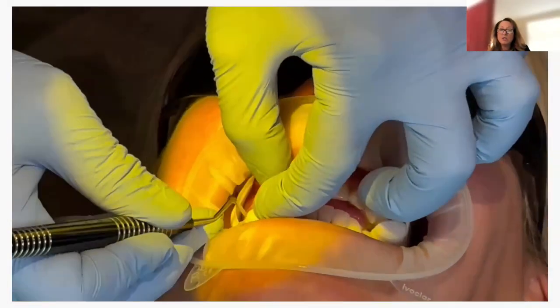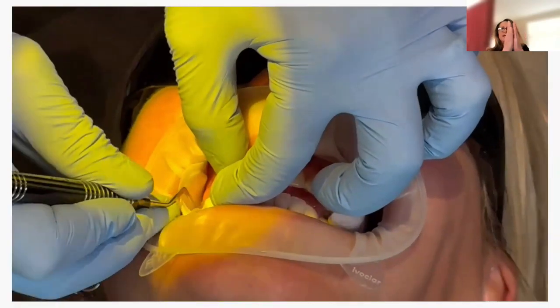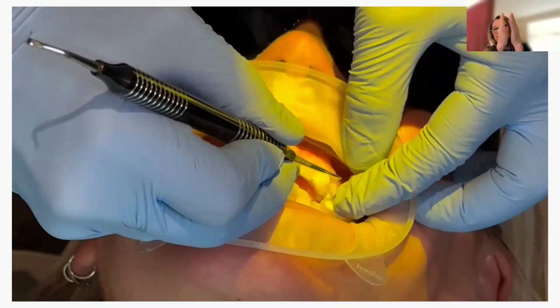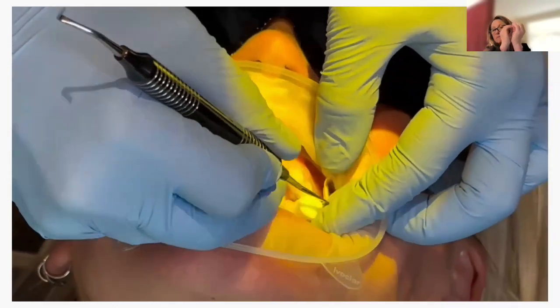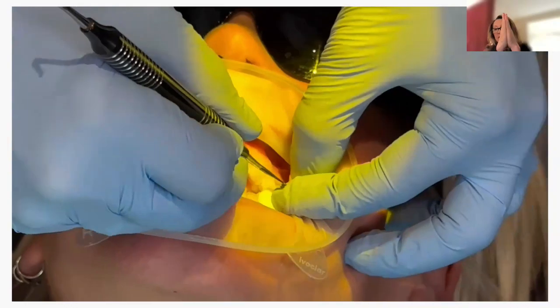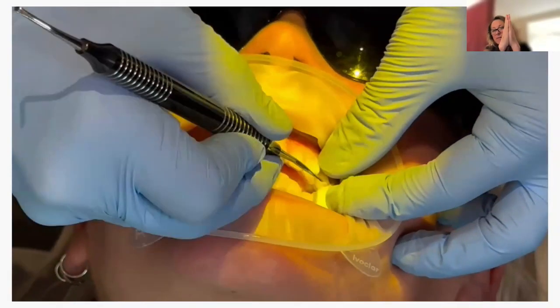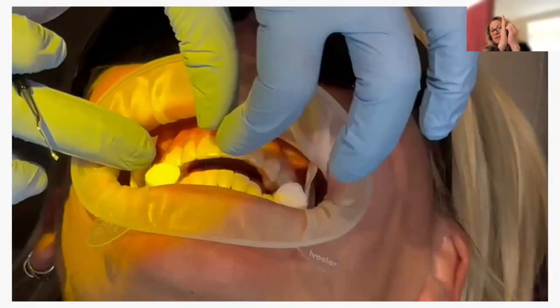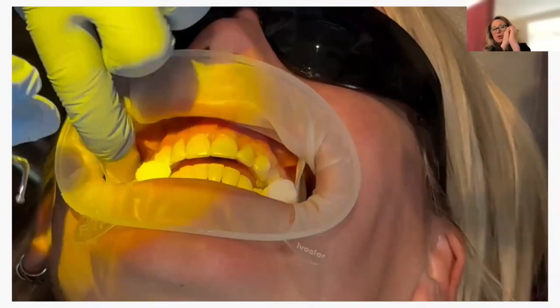While I like to hold the template and press it against the tooth, because templates are very flexible, and I want to engage because I want to make sure that my attachments are there. So I am holding an instrument as I'm doing my light cure.